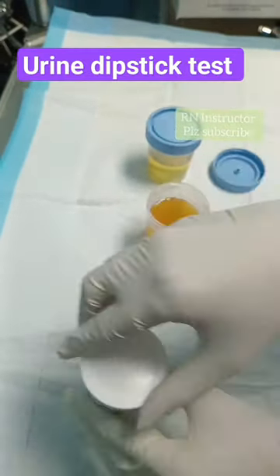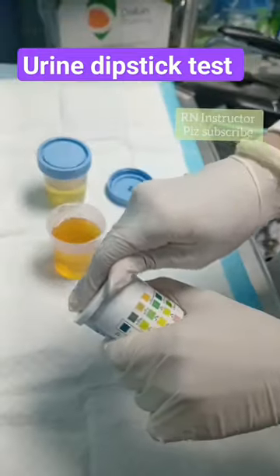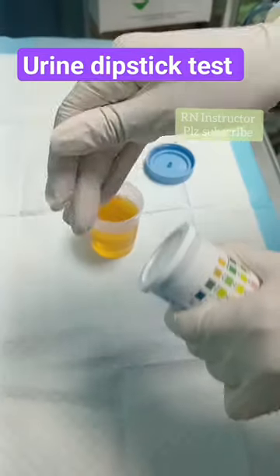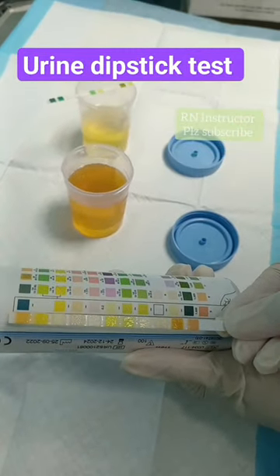First of all, the strips need to be kept in a very tight and closed container. The strips must not get exposed to light, or else they will not give effective results.